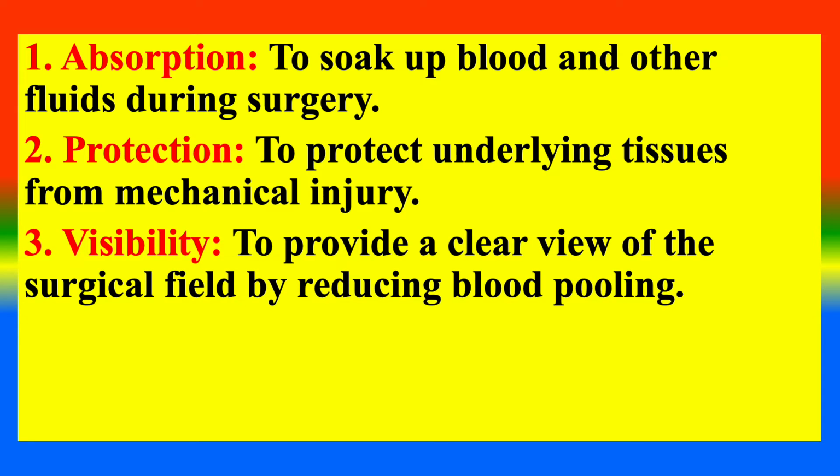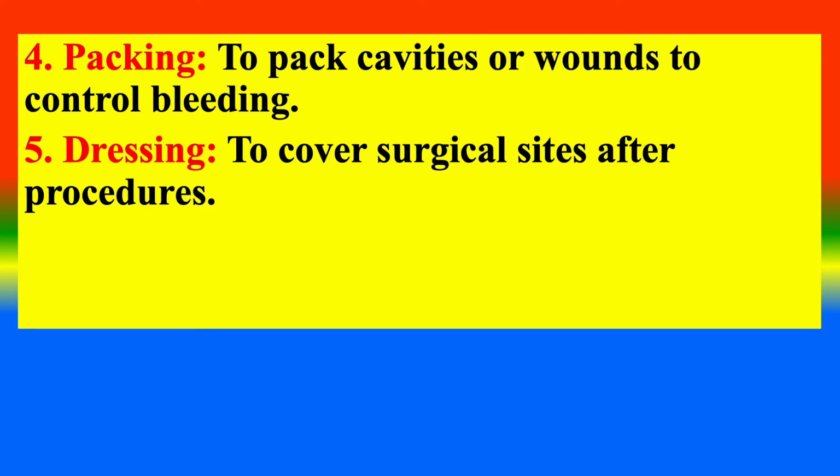Visibility, to provide a clear view of the surgical field by reducing blood pooling. 4. Packing, to pack cavities or wounds to control bleeding. 5. Dressing, to cover surgical sites after procedures.